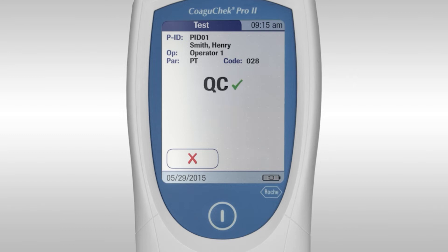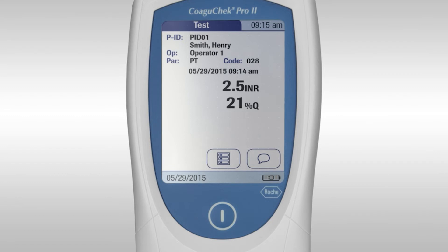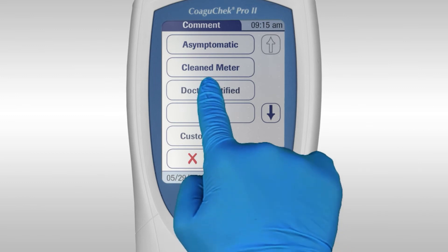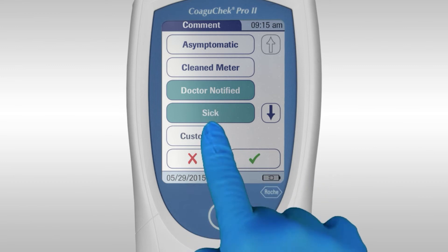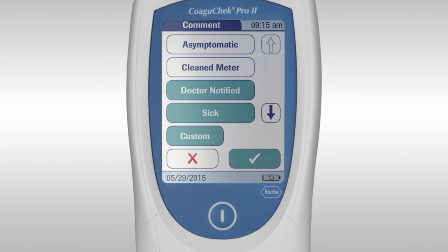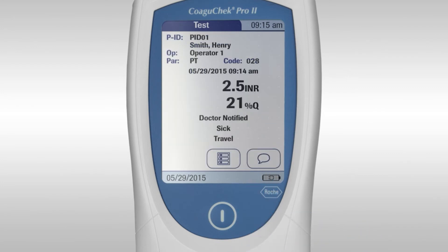The measurement starts and an automatic quality control test is performed. A QC sign and a green tick indicate the automatic quality control has passed. The result is displayed and automatically saved. Before ending the test there is an option to add a comment — to do this, press the speech bubble symbol. You can select up to three predefined comments or add a custom comment. Once selected, press the tick button to confirm the entry. The comments will be displayed under the result.